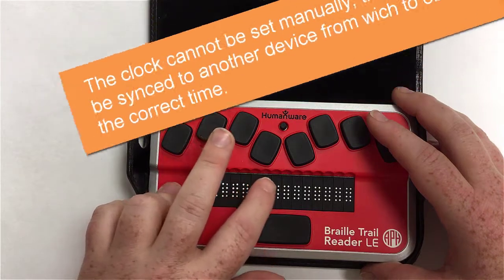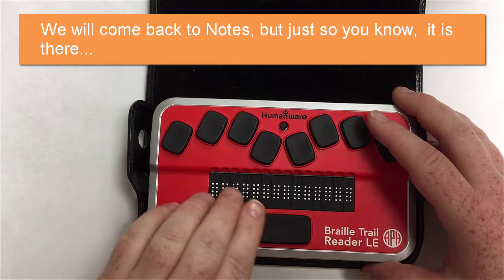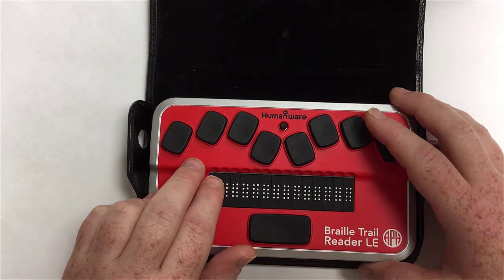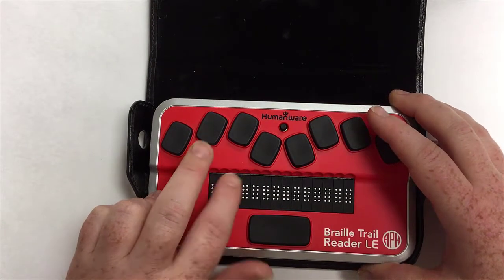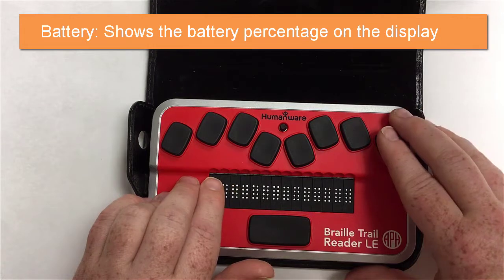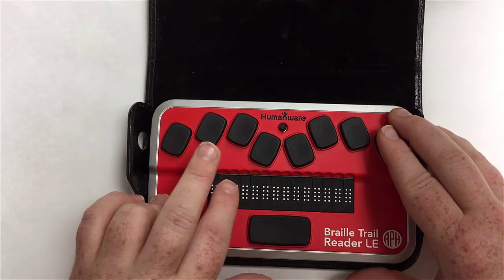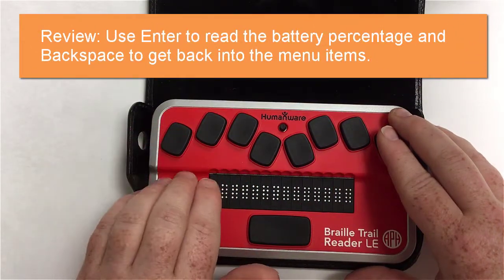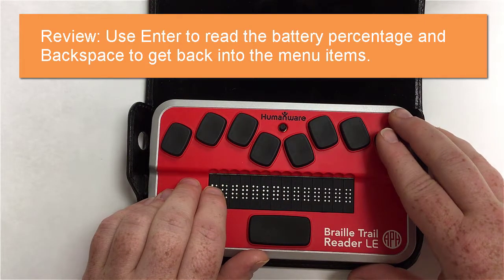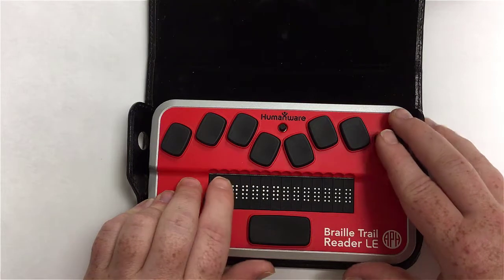We'll get to talking about notes later. The next menu item is battery. To check it, I'm going to use a cursor routing key above it, and it says I'm at 92%, which is nice. Then I'll use backspace to get out of there. You might have heard the cursor routing sensor vibrate a little bit — that let me know I was in that menu, and I wanted to demonstrate that way of getting in.